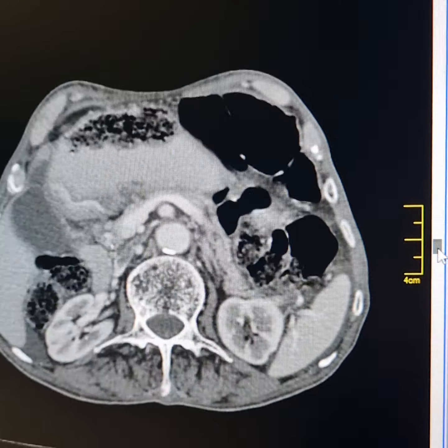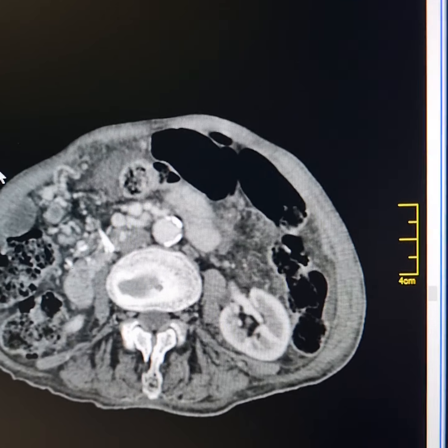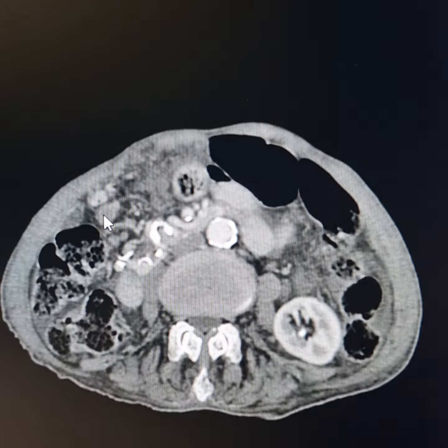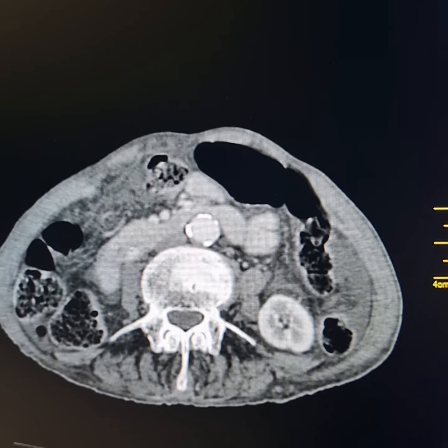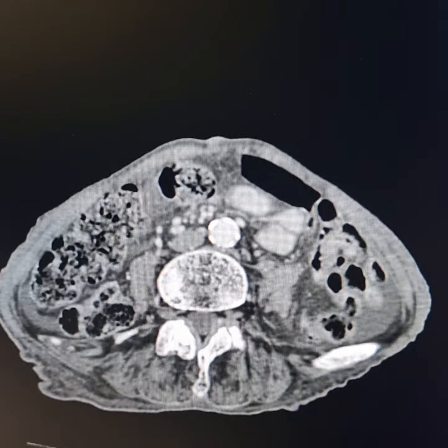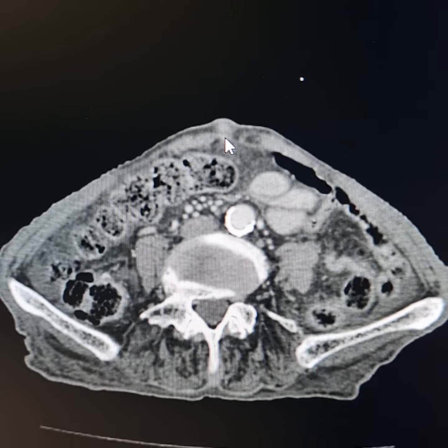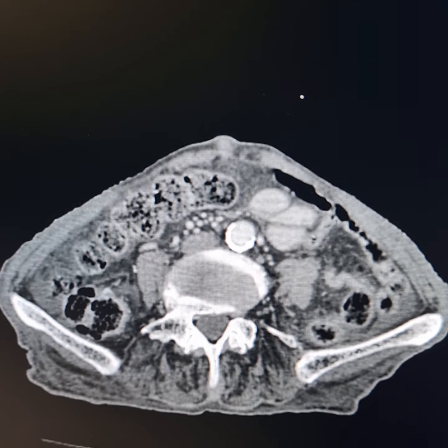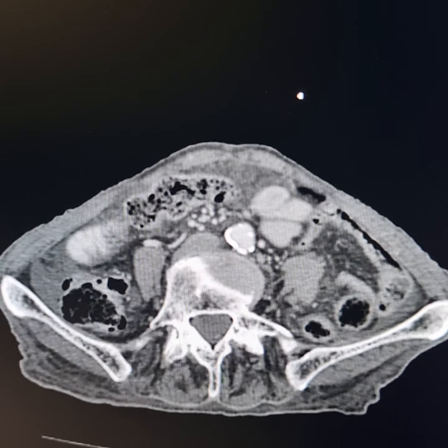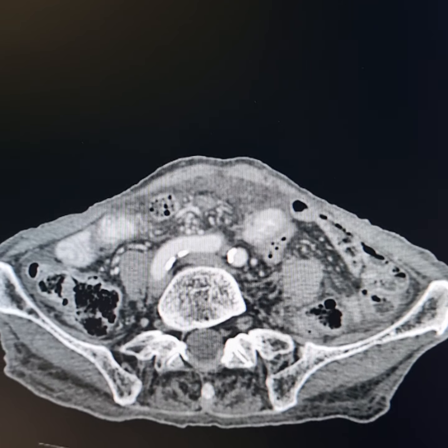There are a few slightly enlarged sub-centimeter sized and slightly larger lymph nodes — metastatic. Please observe this nodule in the umbilicus: Sister Mary Joseph nodule. This is the thickened greater omentum here — also metastatic.